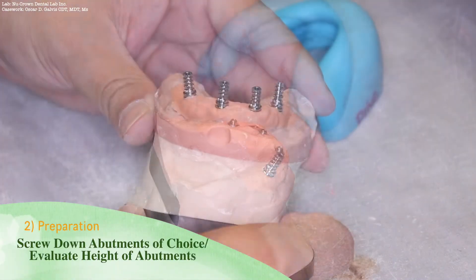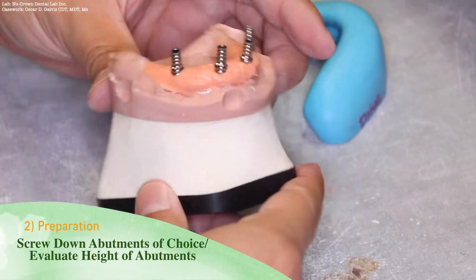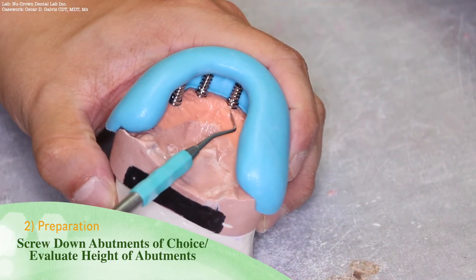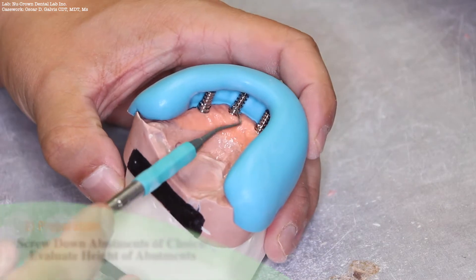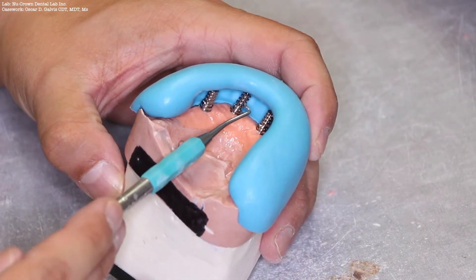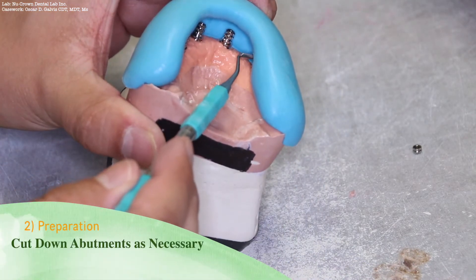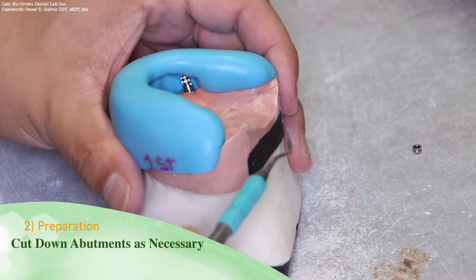In order to prepare properly for the fabrication of the substructure, screw down the abutments and evaluate their heights with the use of the putty matrix. Once the height of the substructure has been determined, you may cut down the abutments as necessary.